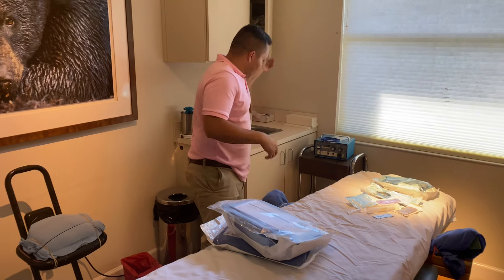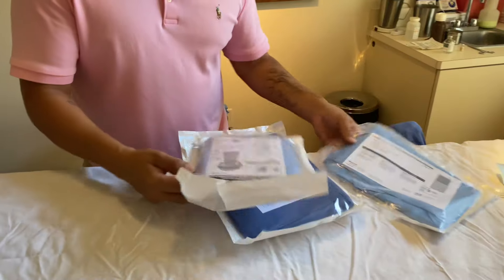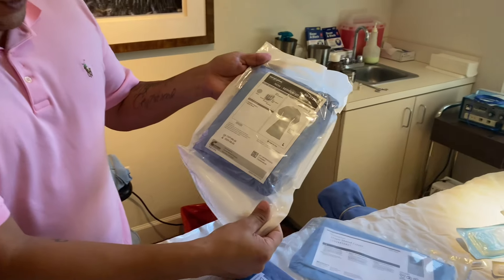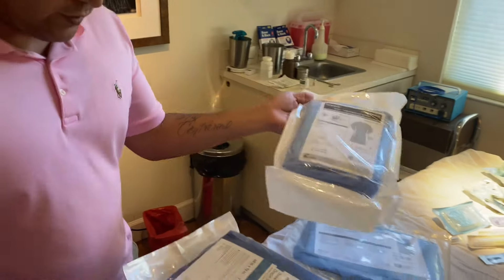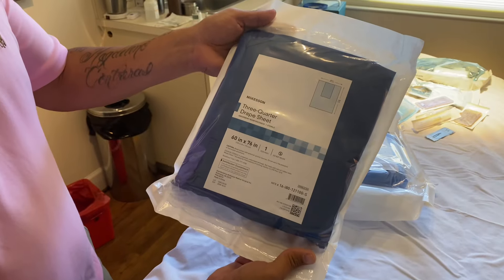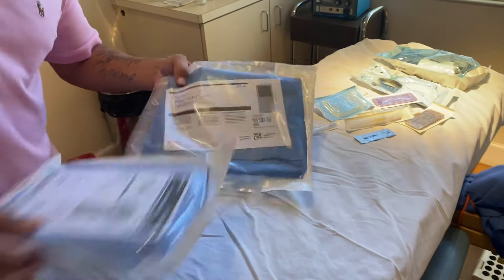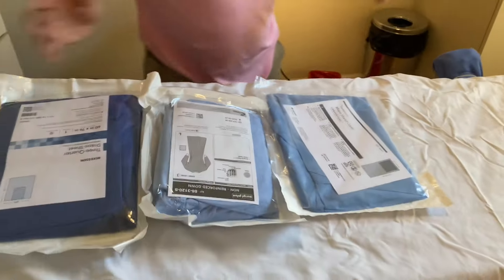Once we already have our 2% lidocaine and the bupivacaine, like a regular vasectomy, we have a mayo cover, we have a large sterile gown, of course all these have to be sterile, and then the three-quarter drape that Dr. Stein will drape out the patient with. So all these three is what we need.